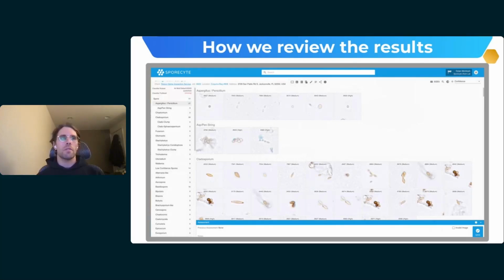This is what our laboratory analysts see. Every other lab in the country will be having analysts look at these slides on a microscope and doing counting and identification on the microscope itself. We digitize the slides, so we present the analyst with digital images. It makes it much more comfortable for them, and allows us to provide these really interesting photos in our reports.